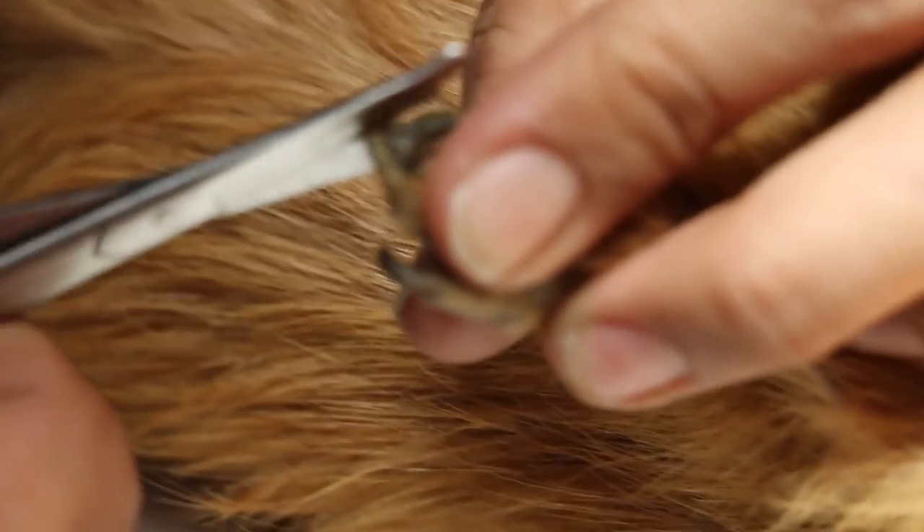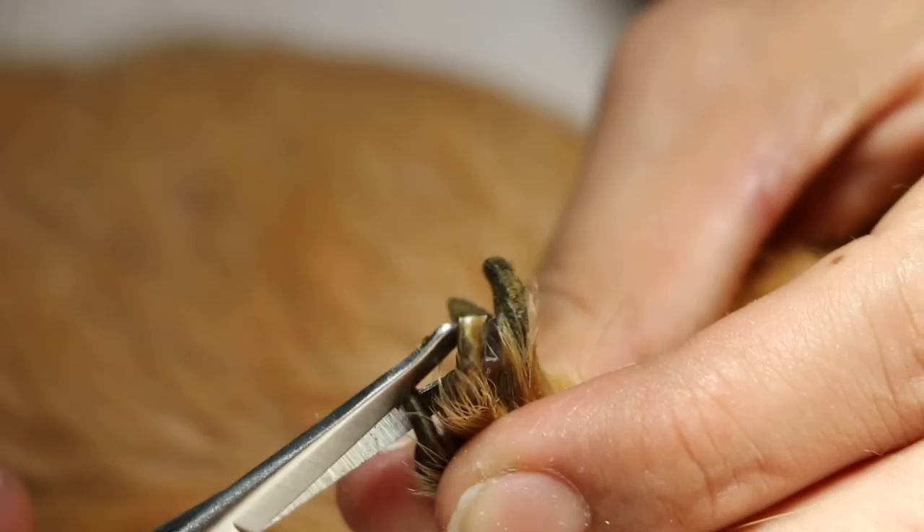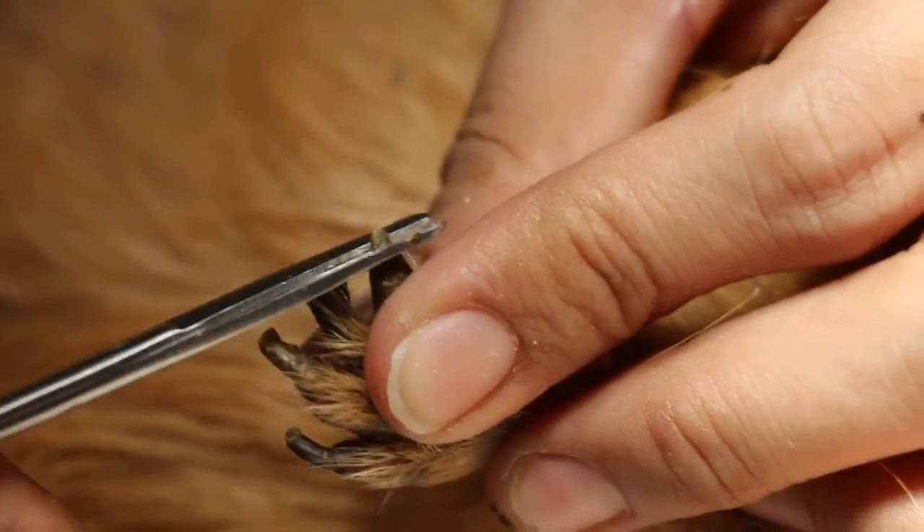I might do the other one first — just do the other one first. Just finish the normal one first, then one more on the other side. I may just use this tool, just do it. Look at the tip here, just use the tip here.